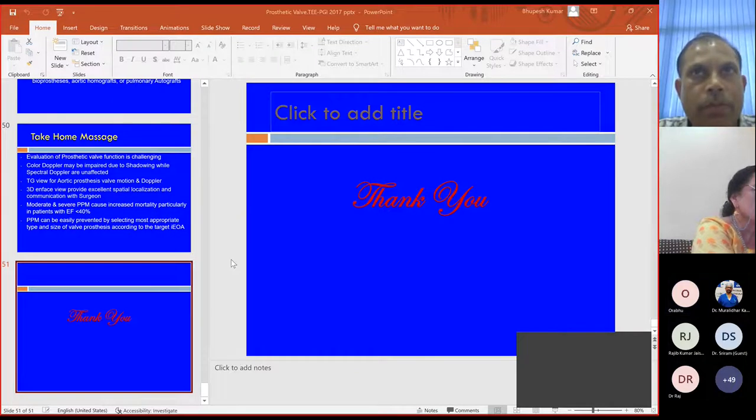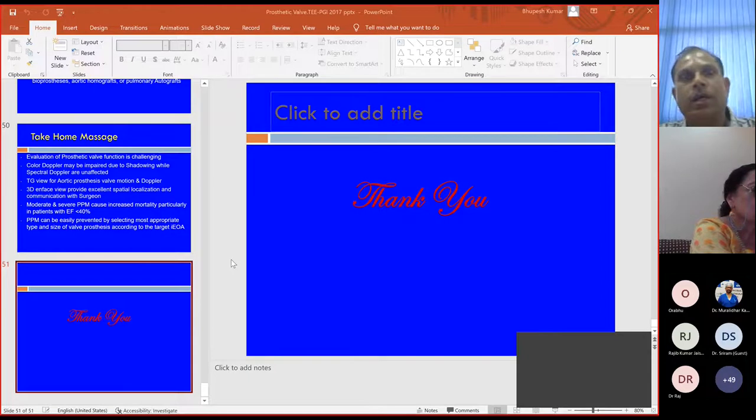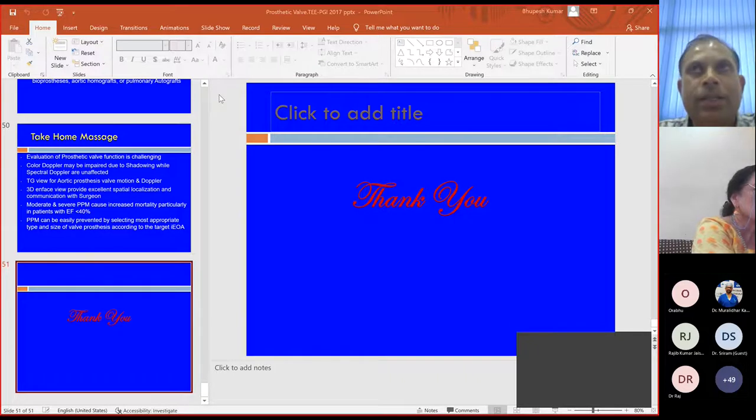220 divided. Yeah. So in case of aortic position, it is the same. However, while measuring the pressure half time, you should look for whether there is other pathological regurgitation present or not. Like if you are measuring across the mitral position, there should not be aortic regurgitation. If it is present, that might affect the values of pressure half time.